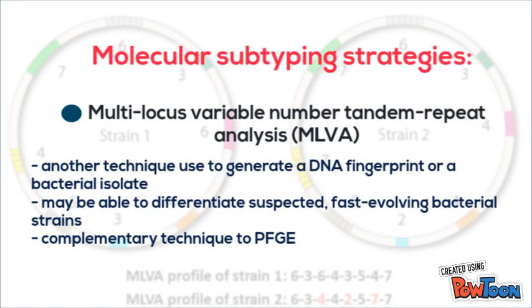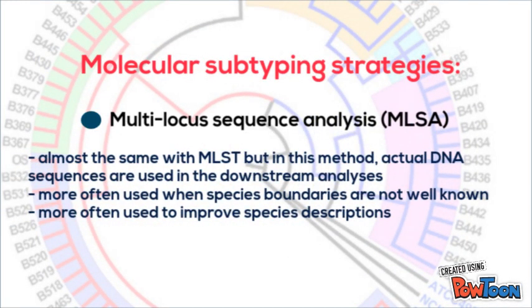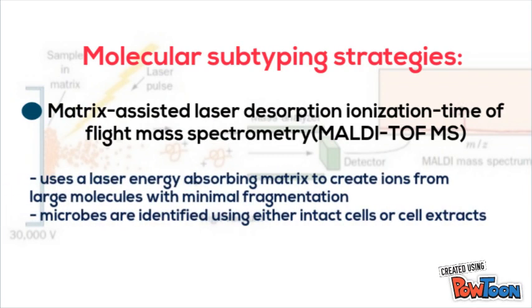Multi-locus variable number tandem repeat analysis. Multi-locus sequence analysis. And matrix-assisted laser desorption ionization time-of-flight mass spectrometry.